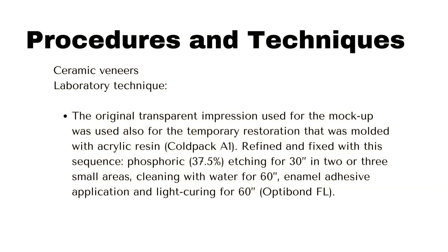Procedures and techniques in ceramic veneers in the laboratory technique. The original transparent impression used for the mock-up was also used in a temporary restoration that was molded with acrylic resin, refined and fixed with this sequence. Phosphoric acid 37.5% etching for 30 seconds in 2 or 3 small areas. Cleaning with water for 60 seconds. Enamel adhesive application and light curing for 60 seconds.